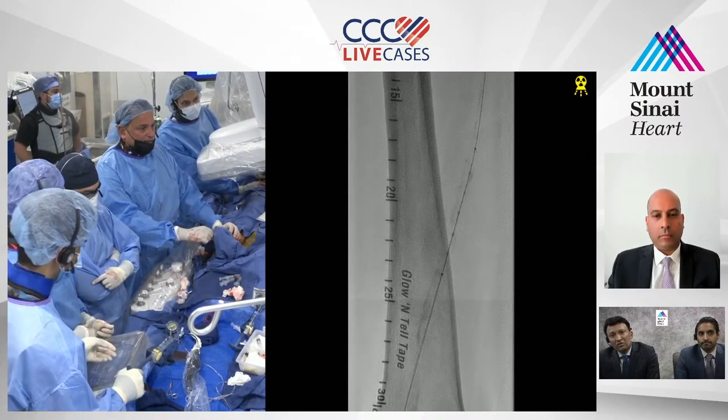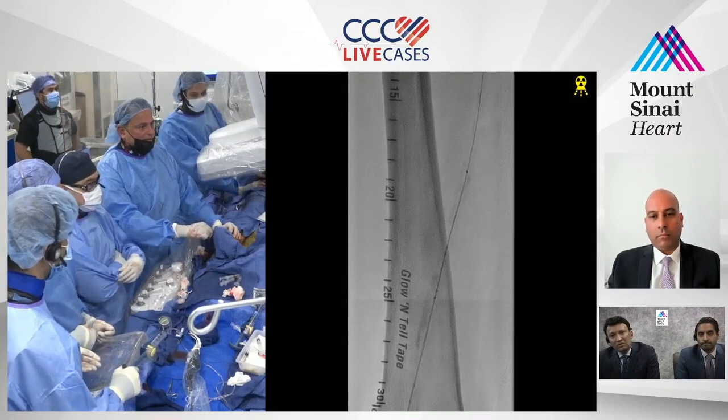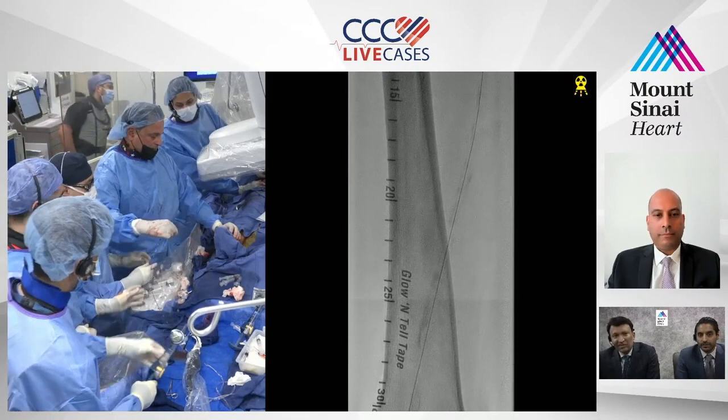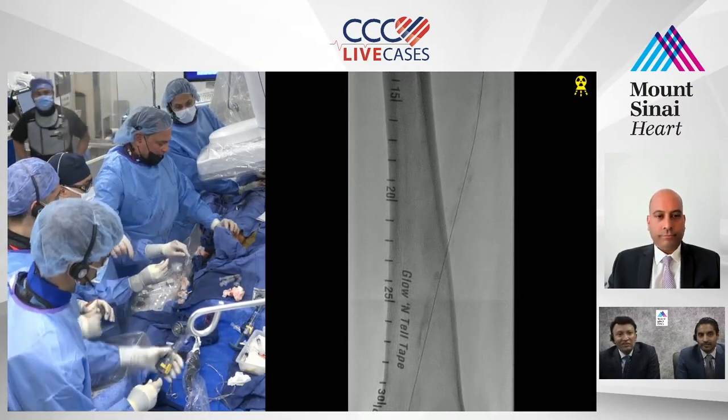You got the wire? Yep. Okay, here it comes. If you have more, just probably shockwave it again then. Yeah, finish the whole thing. I just want to get it out of her body. She's having a lot of pain.